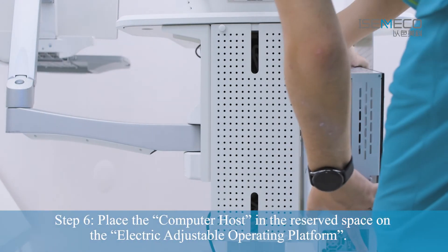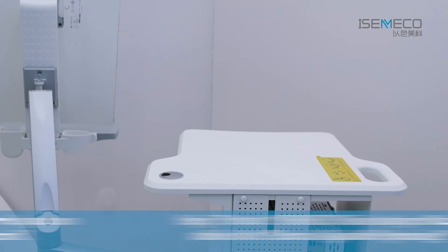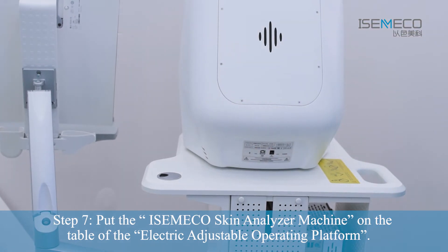Step 6: Place the computer host in the reserve space on the Electric Adjustable Operating Platform. Step 7: Put the Azameco Skin Analyzer Machine on the table of the Electric Adjustable Operating Platform.